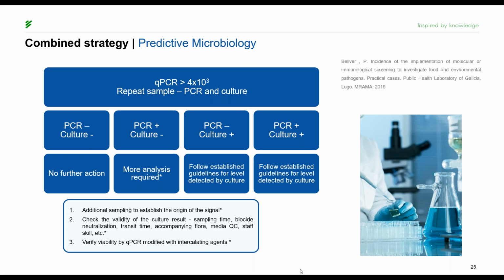If the culture is positive, regardless of the result of the PCR, then we would have to follow the process of samples confirmed by culture. It has to be done according to the legislation. However, if the culture is negative and the PCR is positive, further investigation would be required, since there may be certain reasons that, again, have interfered with the result.